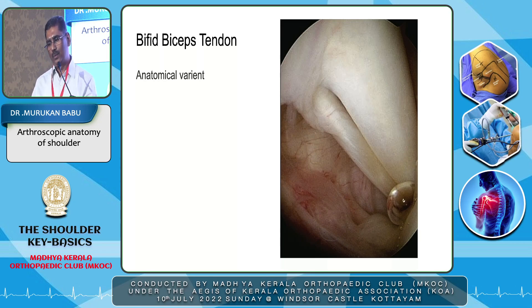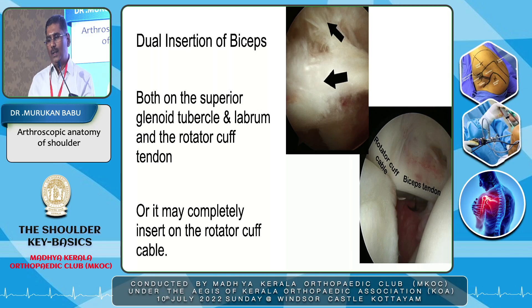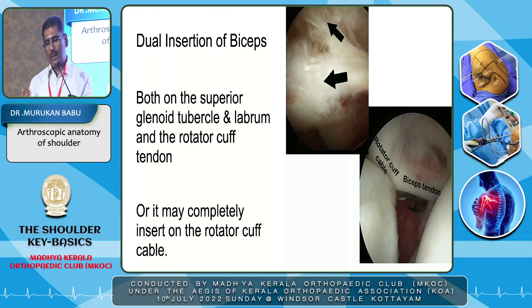How you identify it is by probing these two bands — there won't be any fraying or bleeding between the two tendons, so this is anatomical. Sometimes the biceps tendon can have a dual attachment: usually it is attached to the supraglenoid tubercle and the labrum, but one band can go into the rotator cuff tendon, or sometimes the whole tendon can go into the rotator cuff cable with no attachment at the supraglenoid tubercle. These are all anatomical variants.